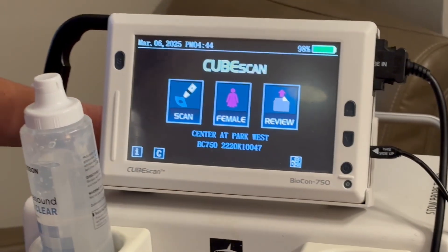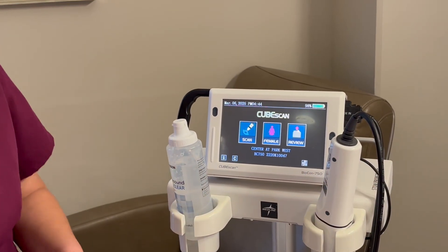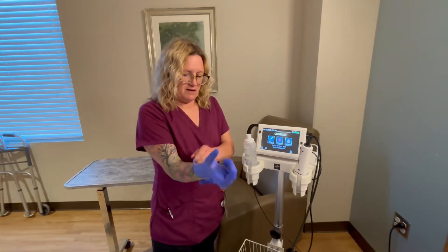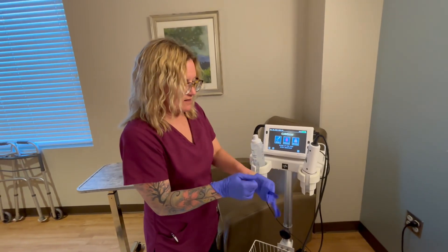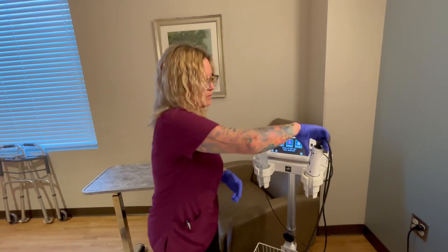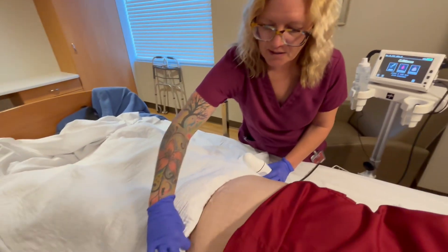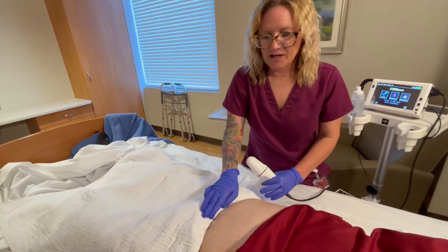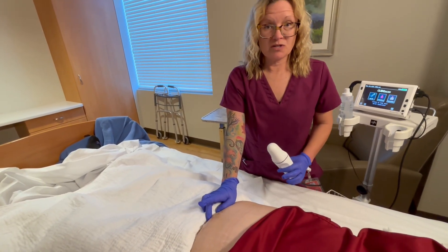So you have a female patient here, and this is the transducer that I'm gonna use to scan it. I'm gonna first apply my gloves, and then I'm gonna take the transducer and place it one to two inches above the pelvic bone. I went ahead and just put a pad here — a towel or whatever — just to protect the patient's clothing. If you feel right here you'll feel the pelvic bone, and you're gonna go one to two inches above that.